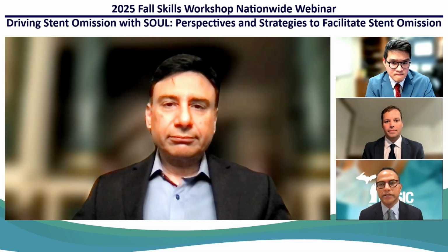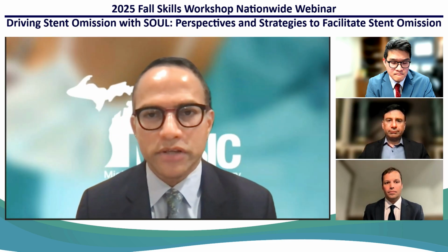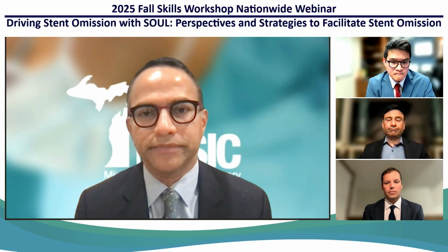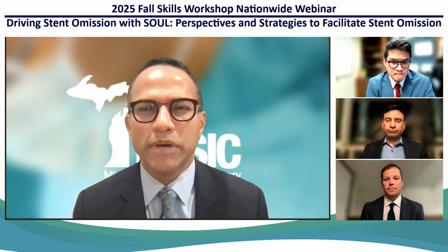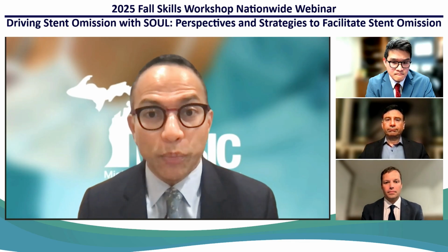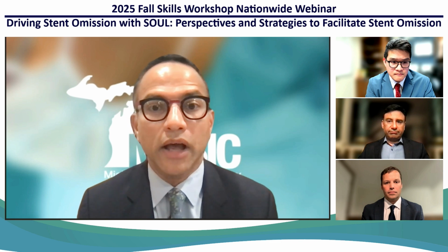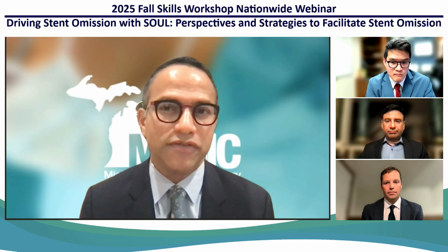Okay. Can I just add on that thread, Mantu, which is I've been using more and more of the slimline, the 6.3, like Casey has, like Wilson in our group. And I think the whole flow of the operating room is much faster. So I think that's something that we should all look at: how many patients can we get through? I've heard from the nursing staff already that what they have to open up in the sets is quicker. The turnover might be slightly quicker. So I think there may be an argument with the health systems, Mantu, if you can study this, to say, hey, I can get more cases in. You only need to get 1 or 2 more patients in extra. And I think that definitely offsets.